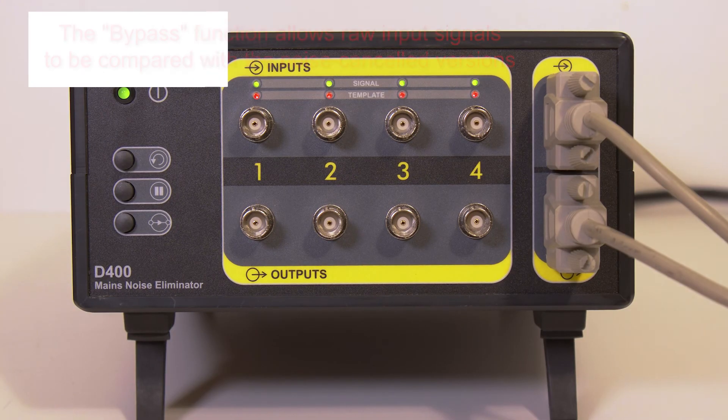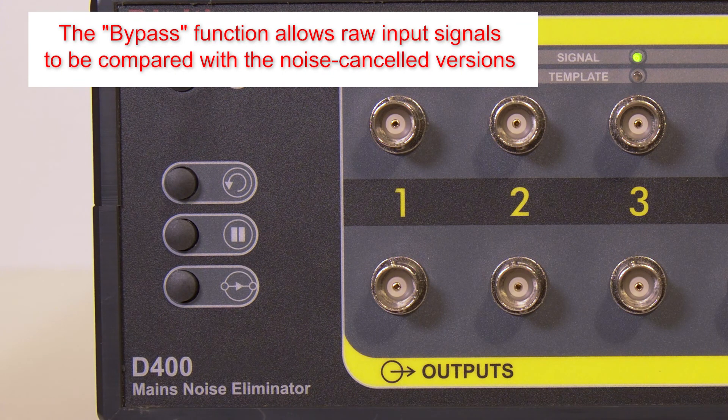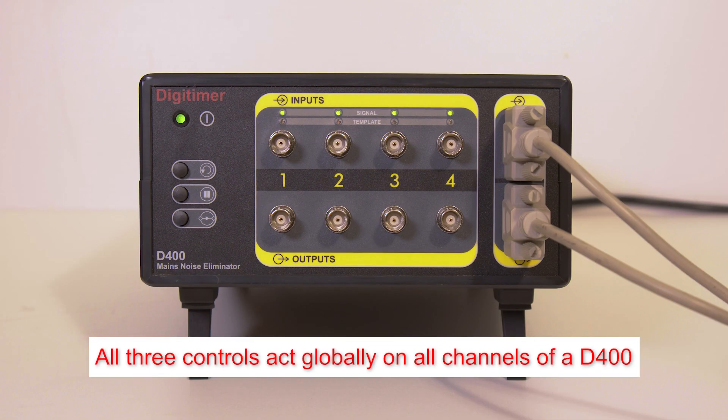The third button is used to bypass the D400, in effect allowing the raw input signal to pass straight through with no noise elimination. This allows the user to compare the raw signals with the noise cancelled signals. All three front panel controls act globally on all channels of a D400.